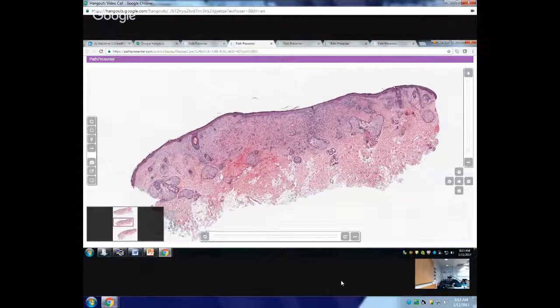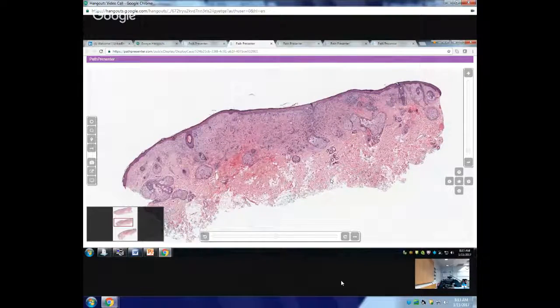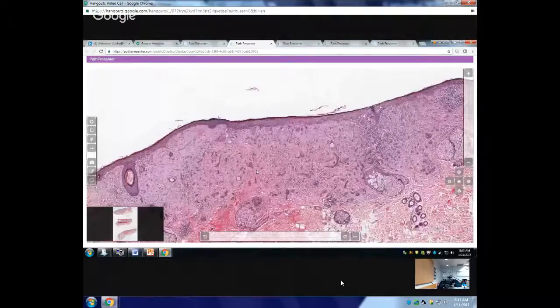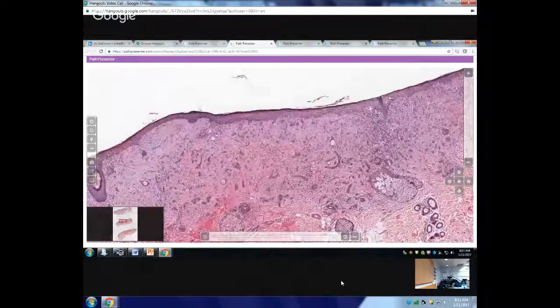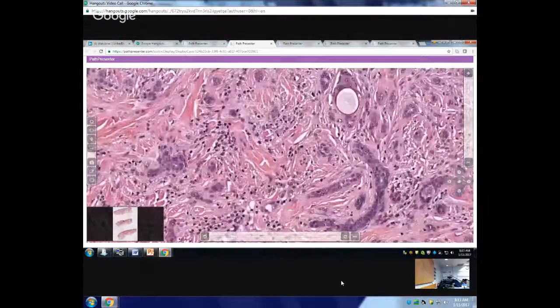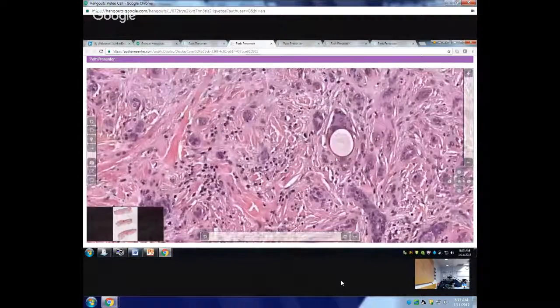Now why is this a trichoepithelioma? What are the features? One, it is composed of these basaloid structures, but then you see again the similar structures that you saw in the trichoadenoma. You see these hair follicle-like structures. These are known as keratocysts. Kerato is keratin, and then cyst. So you have cysts that have keratin within them, a cyst-like structure that has keratin in it. That is known as a keratocyst.